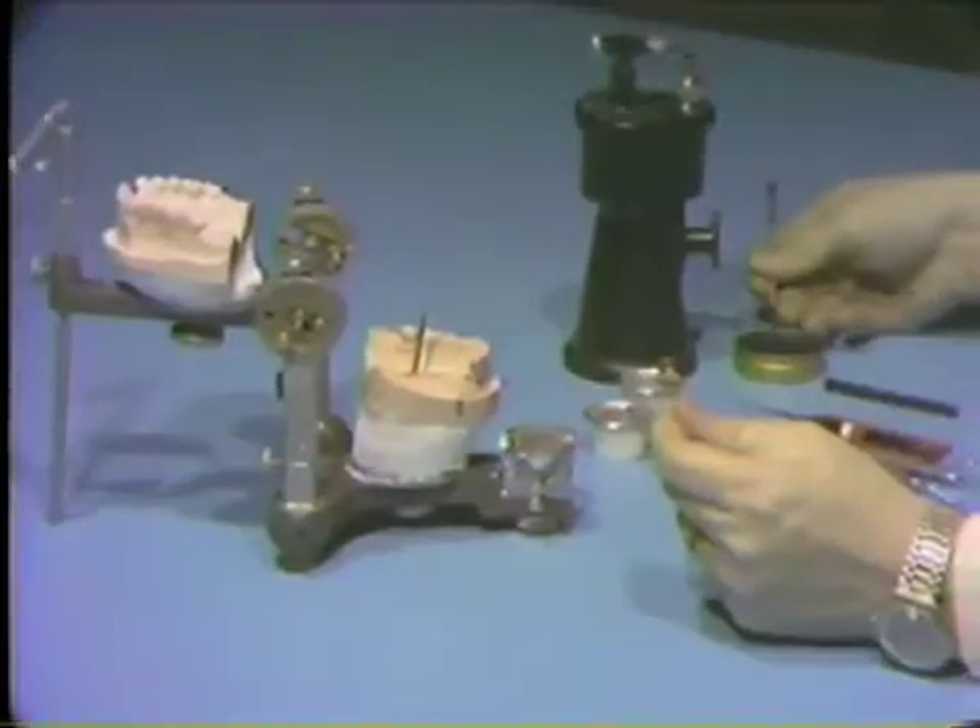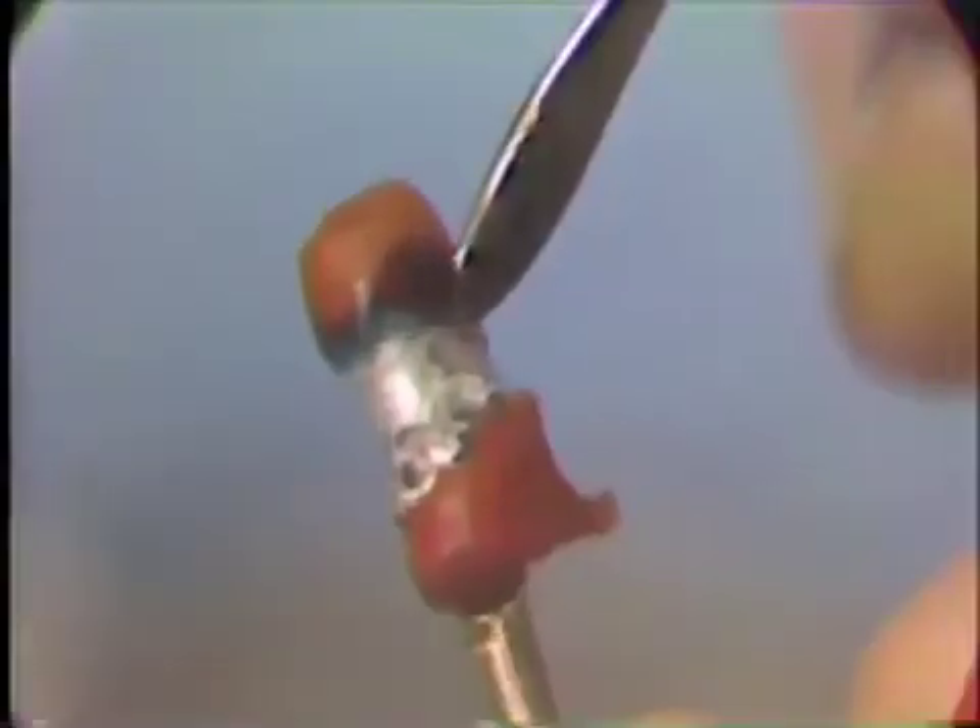After the coping is acceptable, add soft green wax to the cervical edges of the coping, extending to the margins of the die. Add this wax slowly and in fairly small increments so you can finish the margins of your crown wax up in this soft green wax.